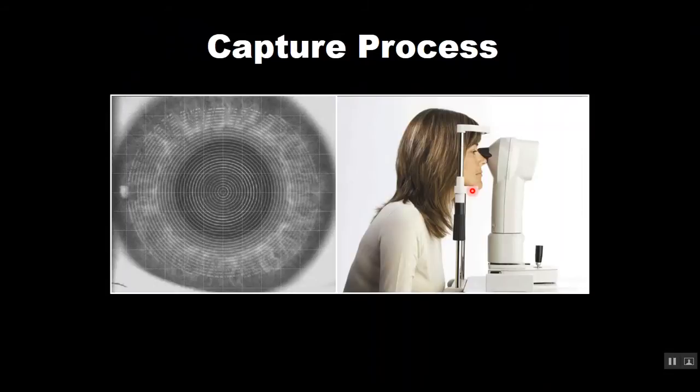Now the capture process is critical, as you would imagine, especially pre-treatment. The first topography that we take determines the initial lens that we place on the eye. The more accurate the initial lens, the more likely the more accurate our outcome. So spend the time on the capture process.